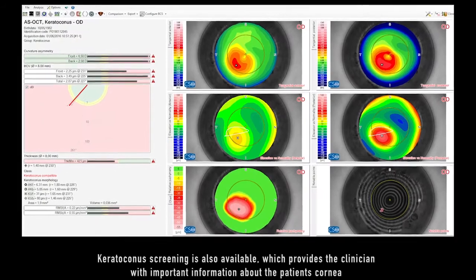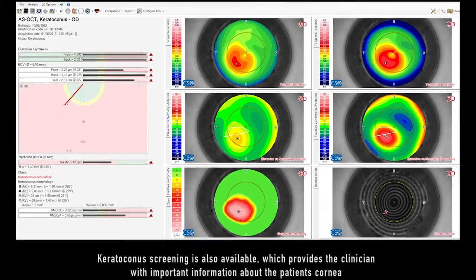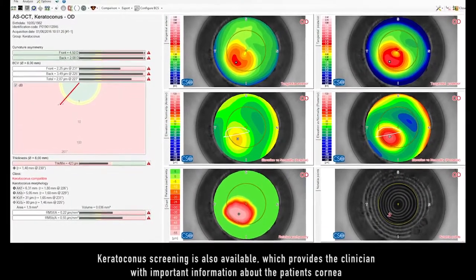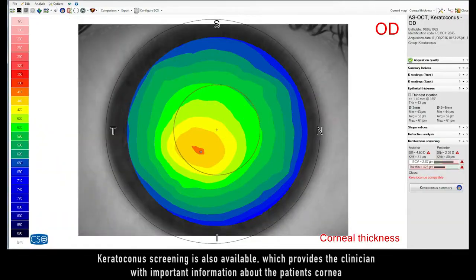Keratoconus screening is also available, which provides the clinician with important information about the patient's cornea.